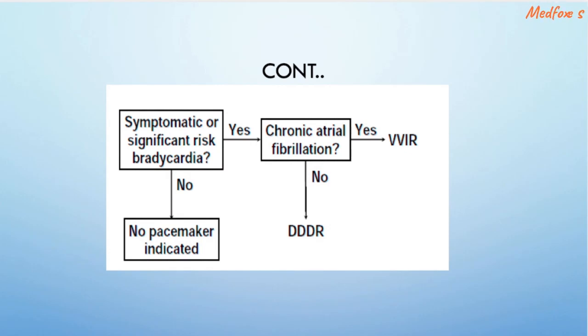However, even in the most ill patient in whom a pacemaker is being implanted, one must be certain that a simple device, that is VVI, does not make the patient worse by causing adverse hemodynamic symptoms, for example in the case of pacemaker syndrome.